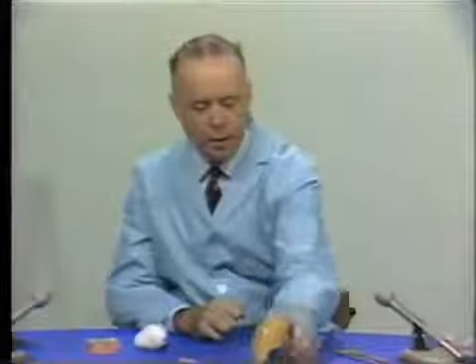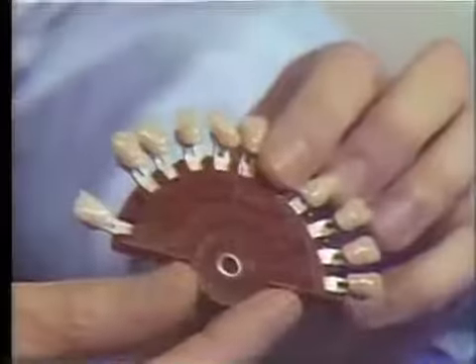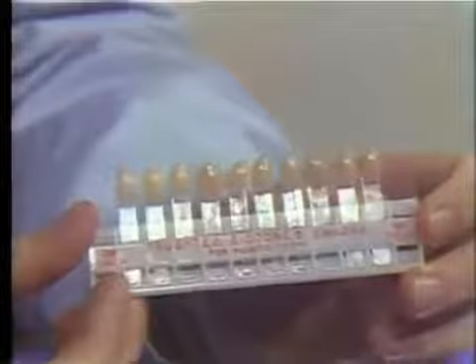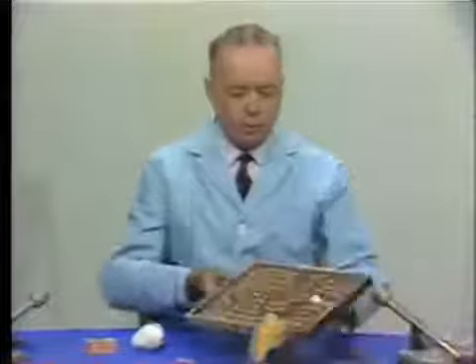Now, these facings are made in regular porcelain, and in selecting those, one uses the same new hue shade guide that you use for a regular porcelain in the Steele's flatback. A few molds, however, have been made recently in resin facing, and these are particularly suitable in repair situations. In that case, of course, you use the biotone shade guide in selecting a shade for the resin facings. Similar types of mold guides are available for use in this situation.